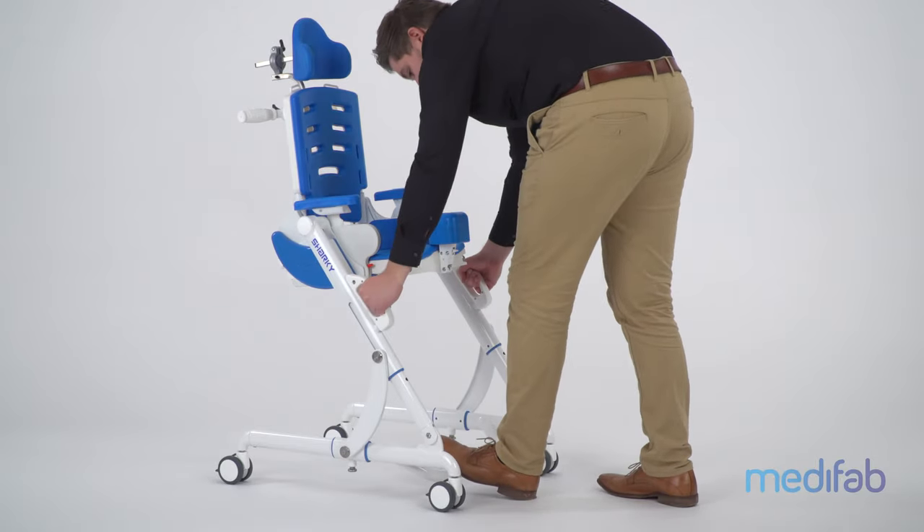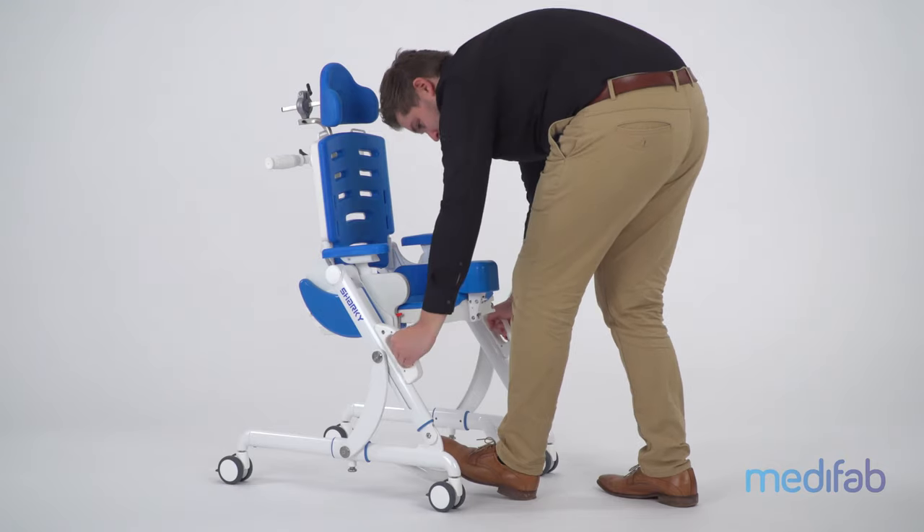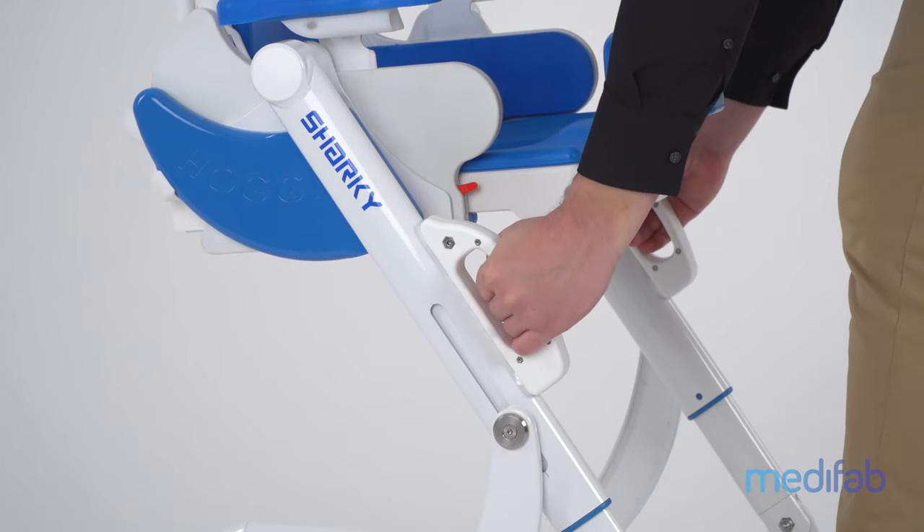The Sharky shower and toilet base can be adjusted to various heights for over-the-toilet use and use in the shower. The gas spring-assisted height adjustment can be locked in four positions.